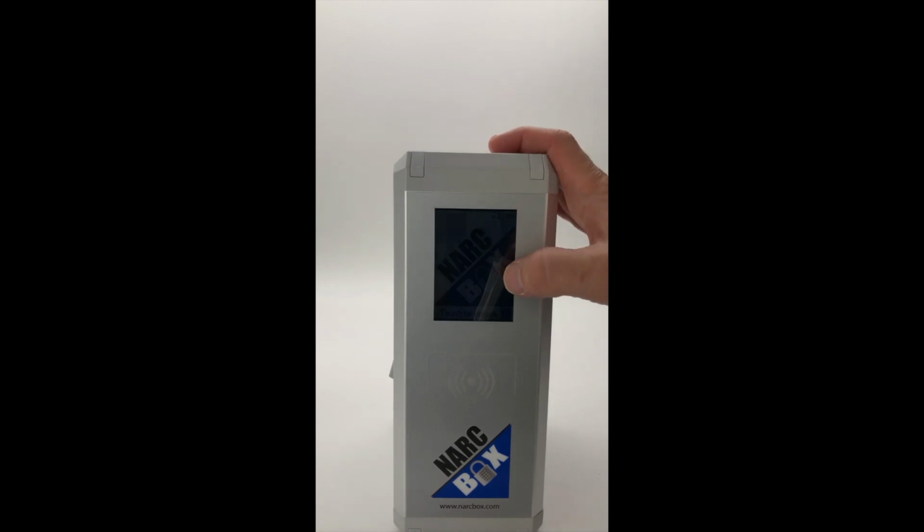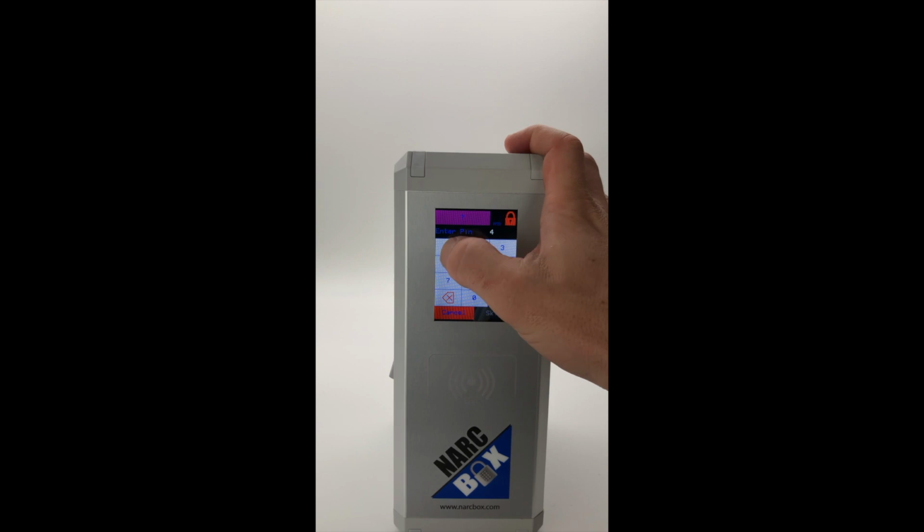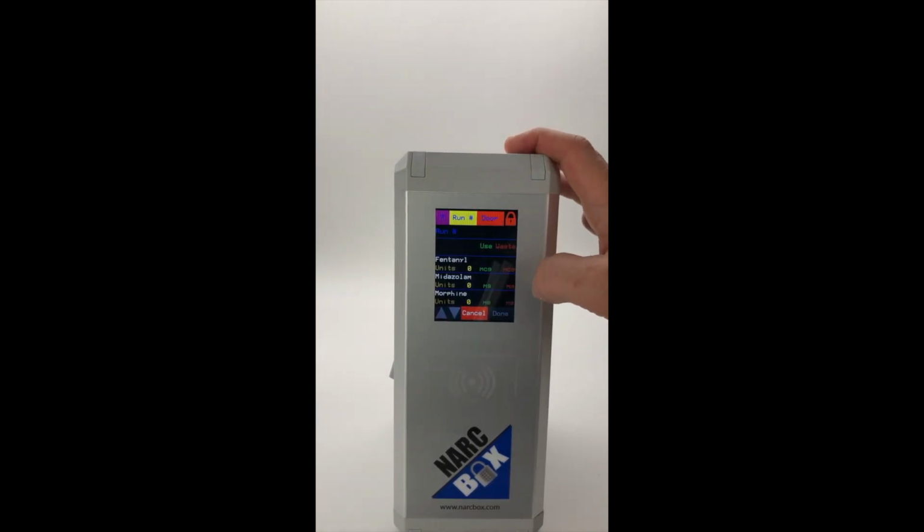To begin, I'm going to go ahead and touch the touch screen, go to the main menu. I'm going to select Log Med Usage because I'm going to actually administer it. It wants to know who this is, so I'm going to put in my PIN, 41611, so that I'll show up as being the medic or the administrator of this particular drug.